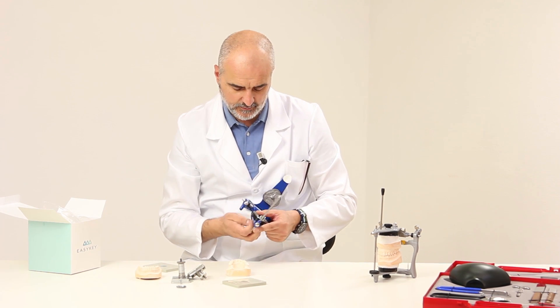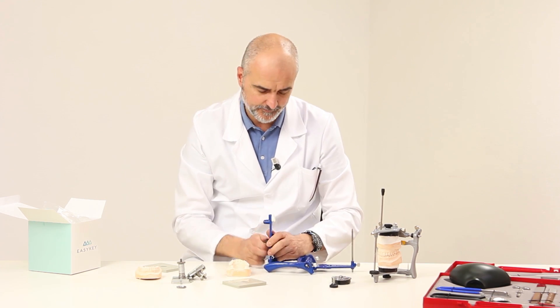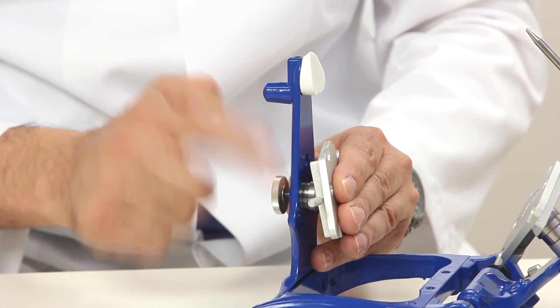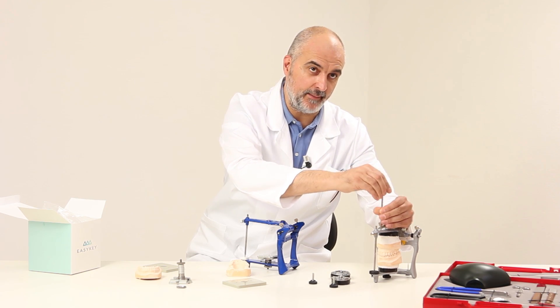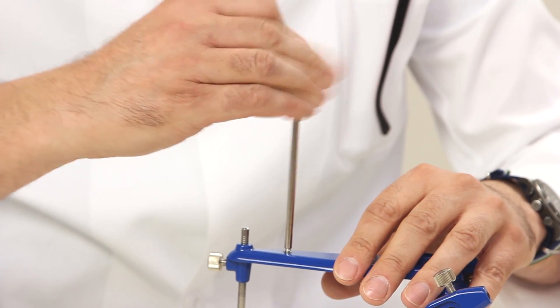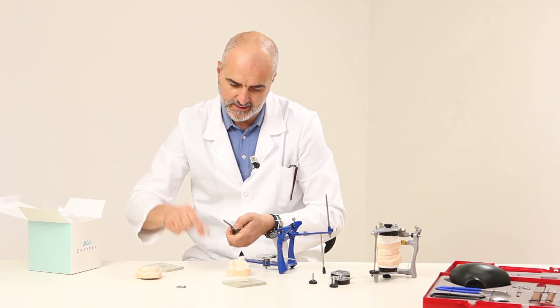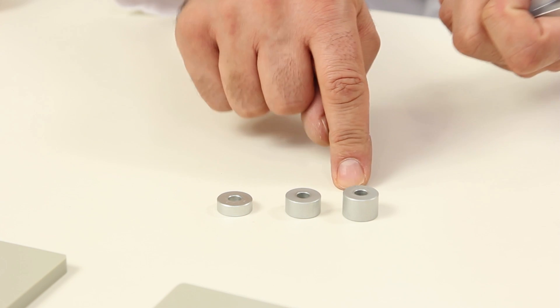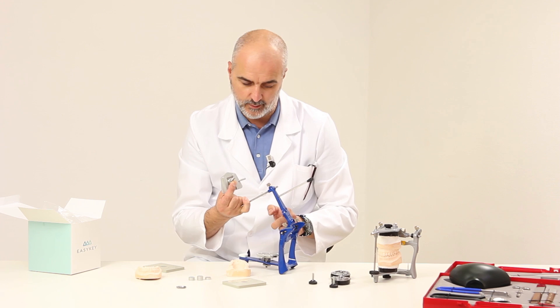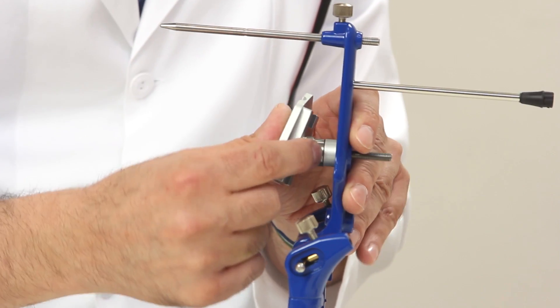EasyKey can be mounted on all Asa Dental articulator models. When screwing in the system, the plates must be completely removed. As we mentioned before, all components are interchangeable, so it's possible to use this rod on this articulator as well. EasyKey features three spacers having different thicknesses — one, two, three. According to the space that must be handled, we'll position them either outside or under the upper part of the articulator. It's important that all three of them are present to allow tightening.